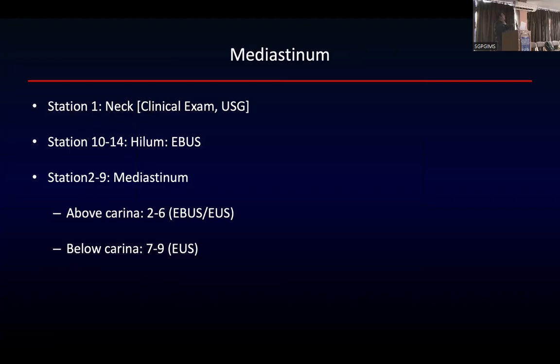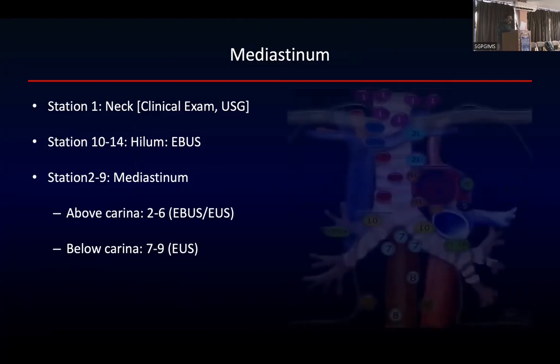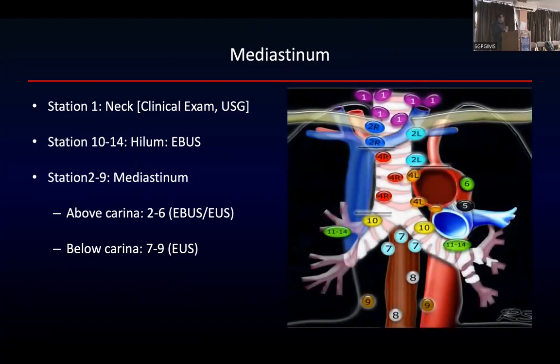People demonstrate that you are able to see the arch of aorta, and then you are able to see the takeoff of the subclavian. To me, it doesn't make any sense. If you just bring the scope up, the patient will start coughing. It becomes very difficult. Moreover, you can do this very well by clinical examination as well as percutaneous ultrasound guided FNA. So this is what the station is.